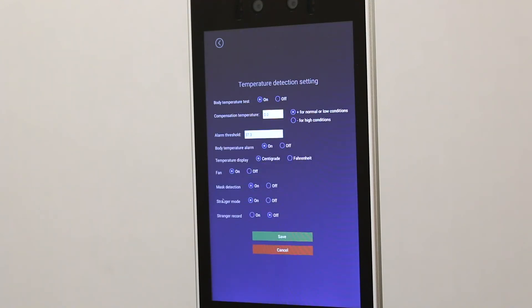Step four, enable stranger mode is switched to off. Step five, click save.